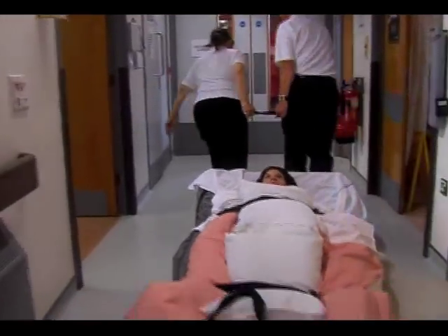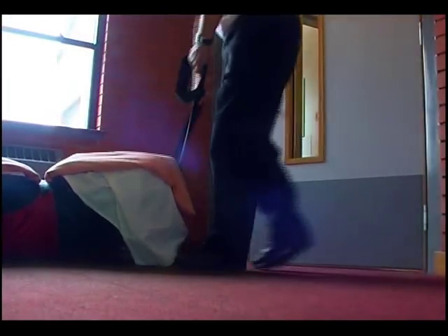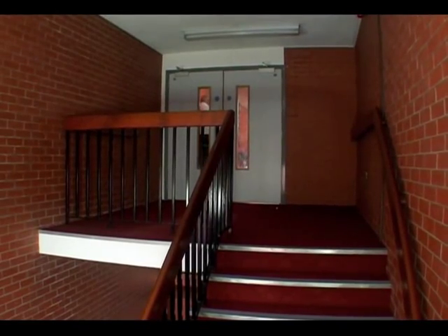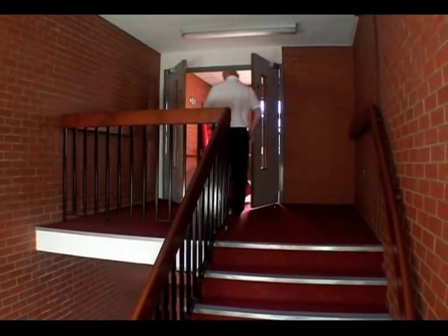The mattress can then be dragged towards the doorway by both or all of the carers pulling from the same end, until the top of the staircase or safe area has been reached. It is recommended that if you have to negotiate swing doors en route, then to protect the head of the person on the mattress, you should go through the doors head first.